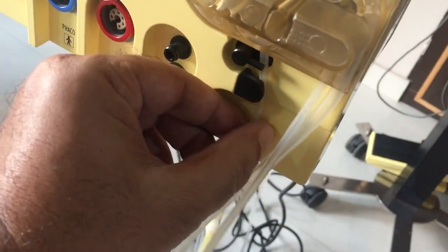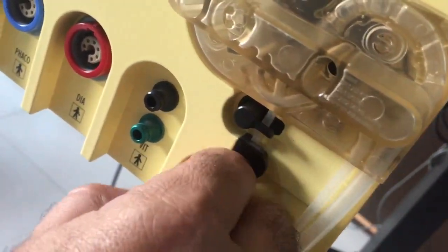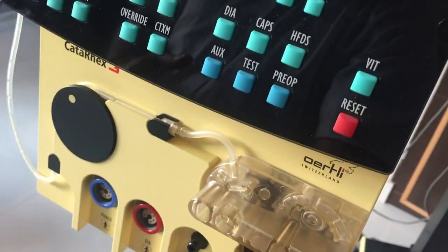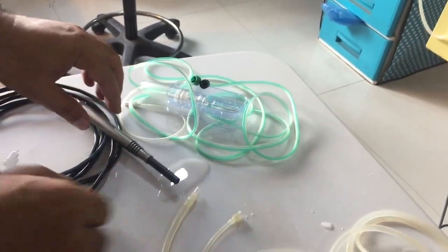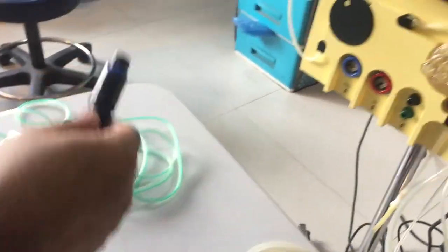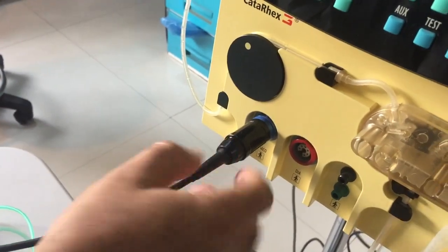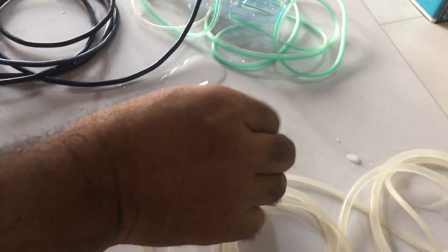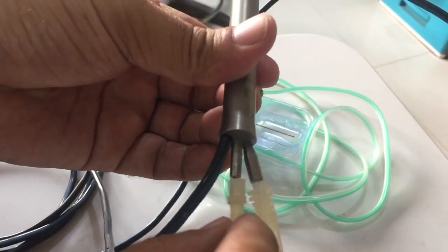tubing, and then you ensure it should be in. This is out, this is in, and ensure the clamp is on the tubing. So we have connected the tubing this way. Here are the two free ends of the IA tubing. Then you connect the phaco handpiece with the machine, and then you connect this irrigation and aspiration tubing with the phaco handpiece.